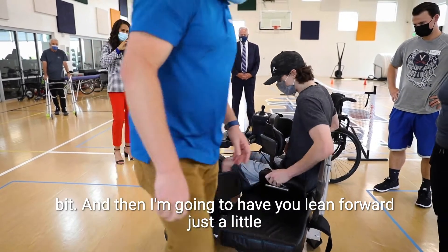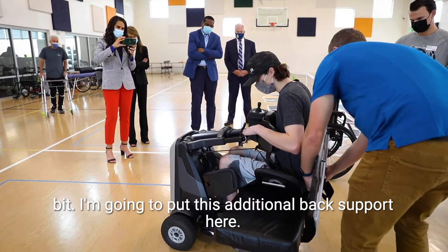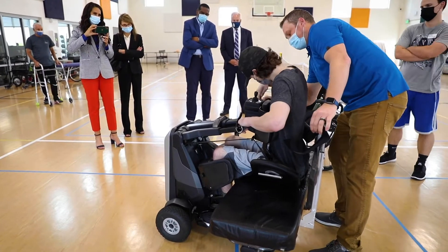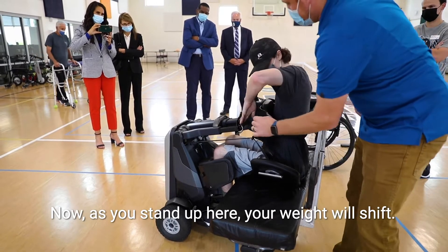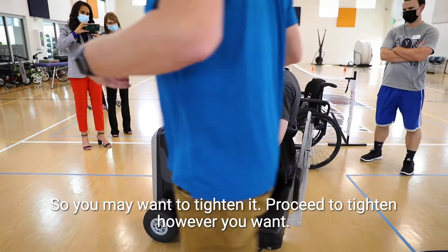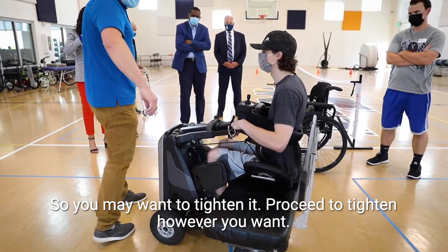I'm just going to start to tighten it back up a little bit, and then I'm going to have you lean forward just a little bit and put this additional back support here. As you stand up, your weight is going to shift, so you may want to tighten that up. It's just Velcro so you can tighten it however you want.